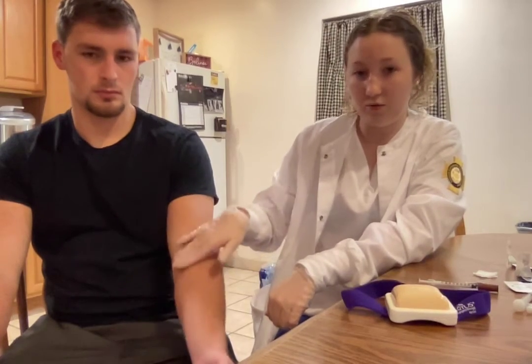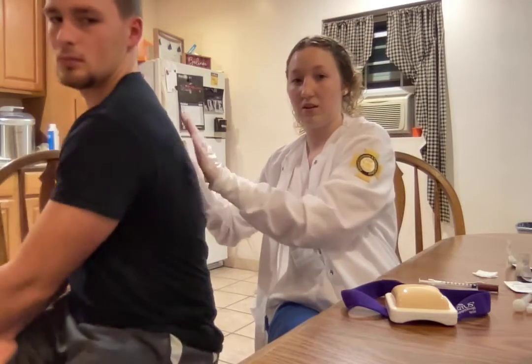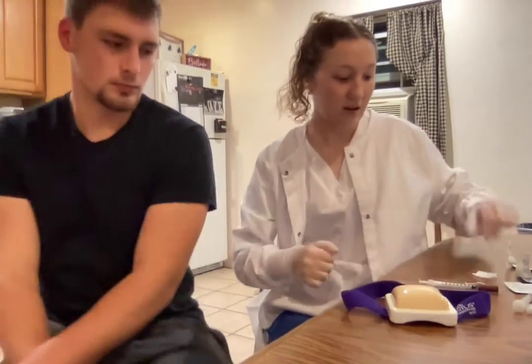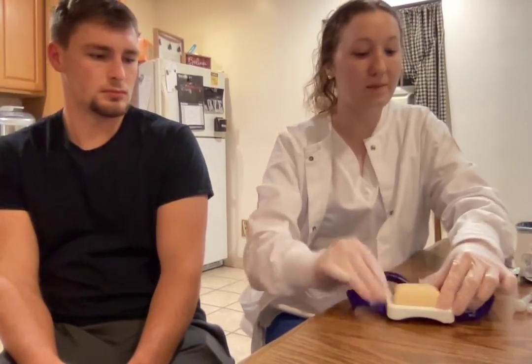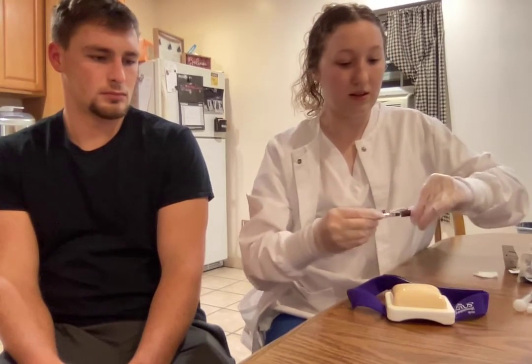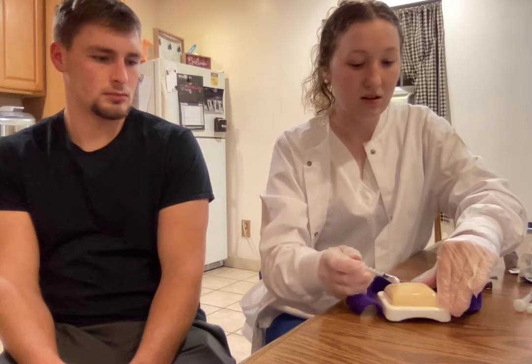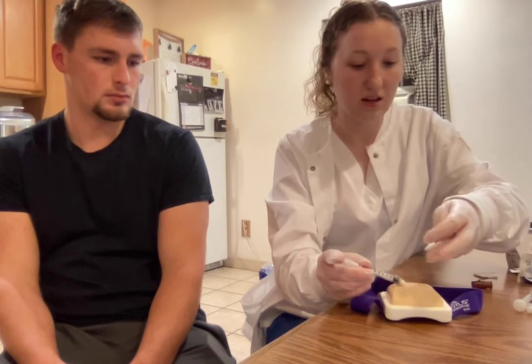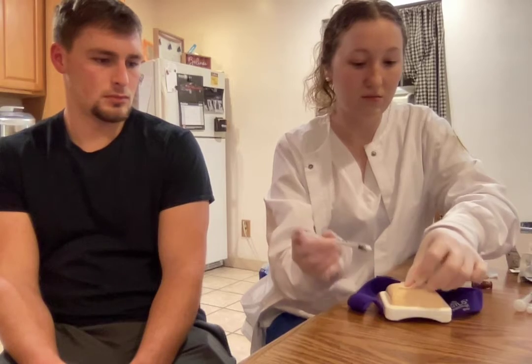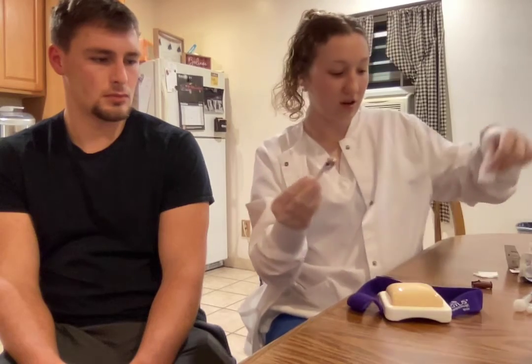And then for an intradermal, you can give that on the inner forearm, or you can also give it in the scapular region of the back right there, and that's usually used for allergy testing. So you take your prep pad and prep their skin. And then this one you want to go bevel up, and you're going to go about 15 degrees below the skin. And insert, and then you'll get a little bubble underneath their skin. And then just pull out your needle, and then you can give them a bandage if they need it. And then that will also go in the sharps container.